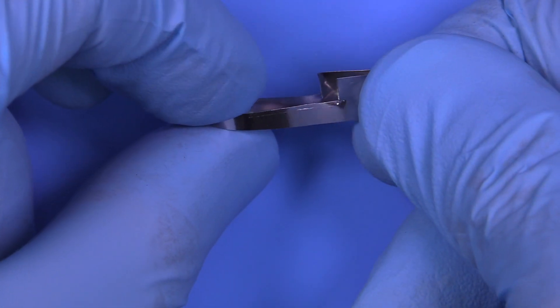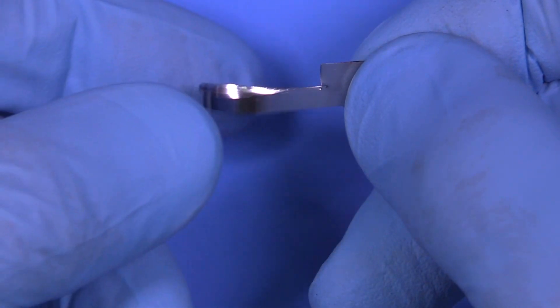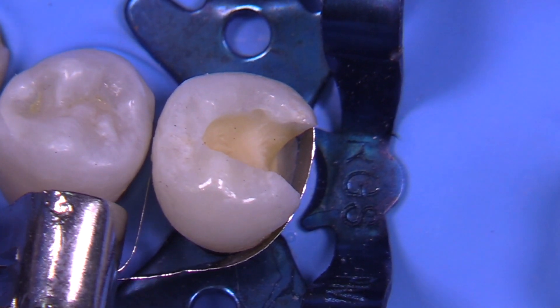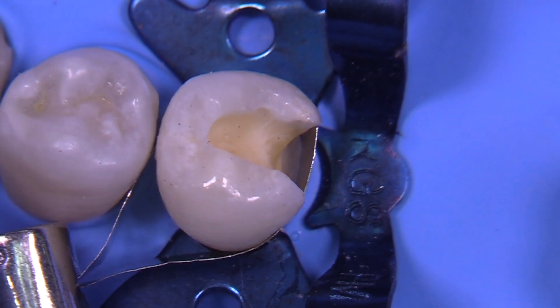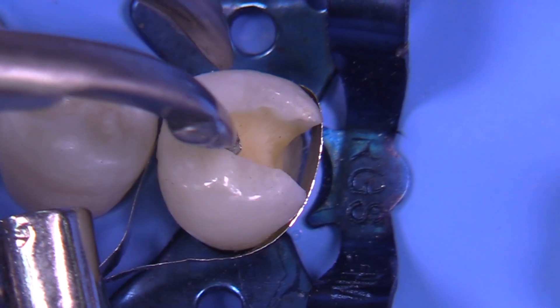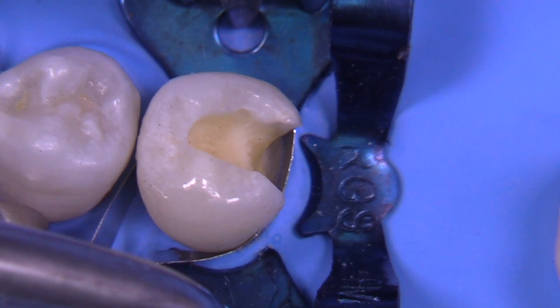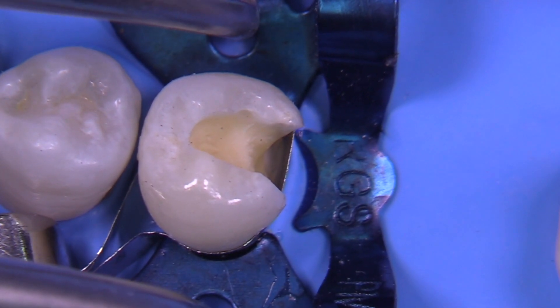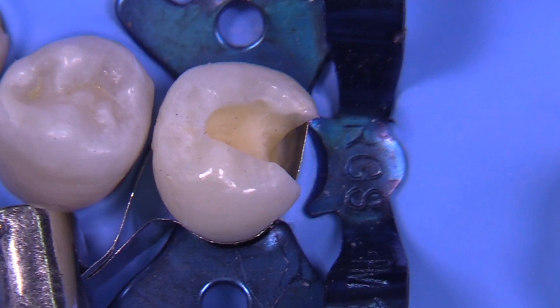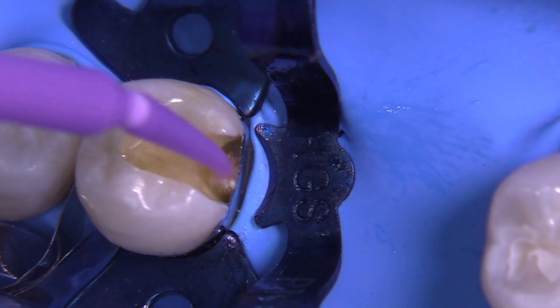I think that's a nice way to make this — leave it thick at the end so you can secure it in the Toffelmire retainer. It's a little tricky to put on. I like to loop it over the tooth, and then sometimes have the assistant hold the rubber dam down. I'm going to grab the rubber dam forceps, release them from the tooth, and slip the band underneath — there it goes. The retainer is now helping secure the band in place; you just don't need a wedge.